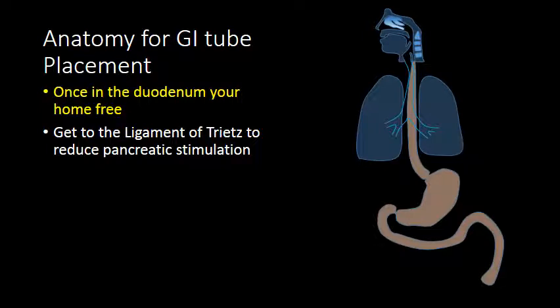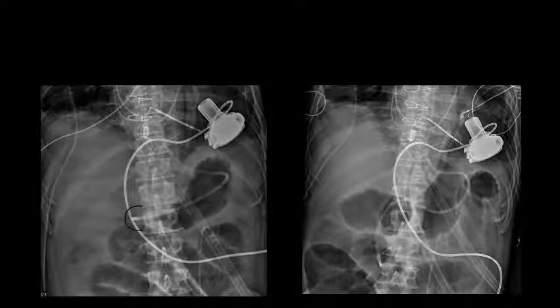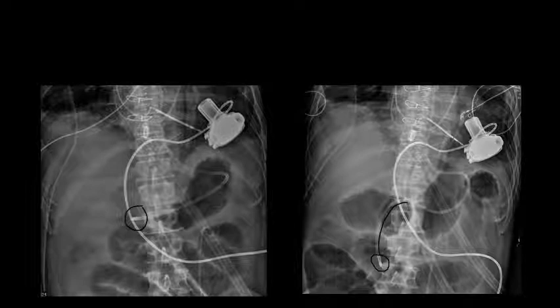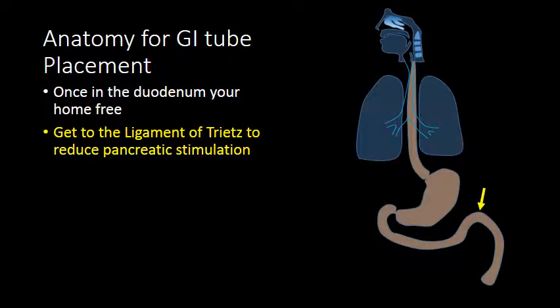Once a feeding tube has passed the pylorus and reached the duodenum, it is usually much easier to advance more distally. Here we have an example of a peripyloric catheter with the tip in the antrum or first portion of the duodenum. The subsequent radiograph shows advancement down the first and second portions of the duodenum, terminating near the junction of the second and third portions — adequate positioning for feeding in patients at risk for aspiration. However, the most ideal placement is for the tip to be at the ligament of Treitz, because positioning in the first or second portion of the duodenum places the catheter at risk for retraction into the stomach, and more distal positioning reduces pancreatic stimulation, important in patients with pancreatitis.